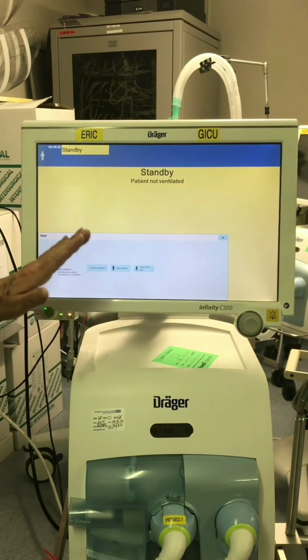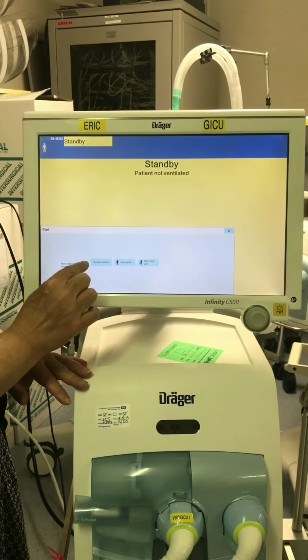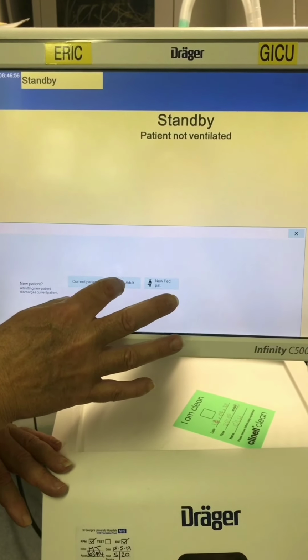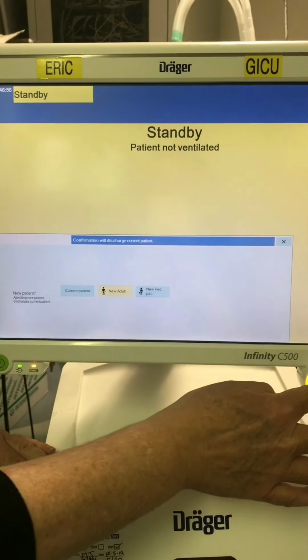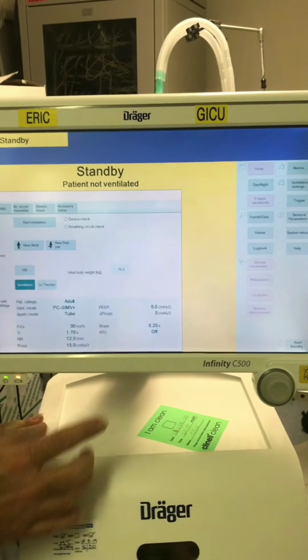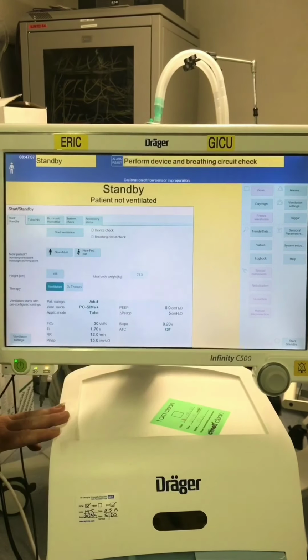So when it's first turned on, you get a standby screen. I can now select whether it's the current patient or a new patient. I'm going to select new adult and confirm. On this ventilator, every time you want to do anything, you have to select and confirm with the control knob.